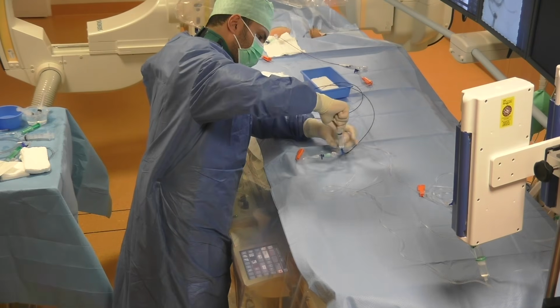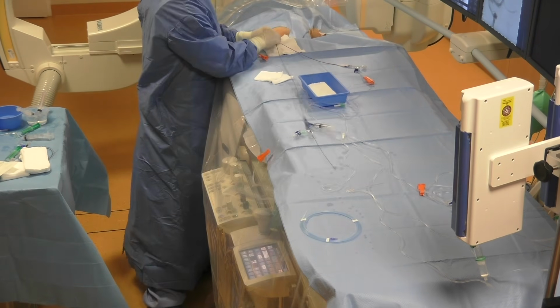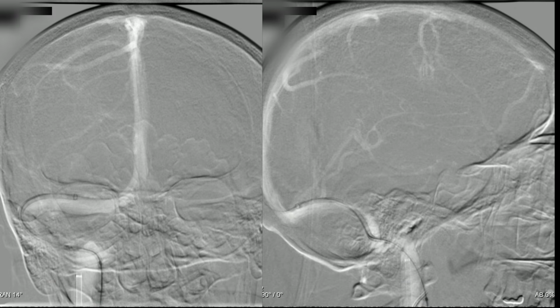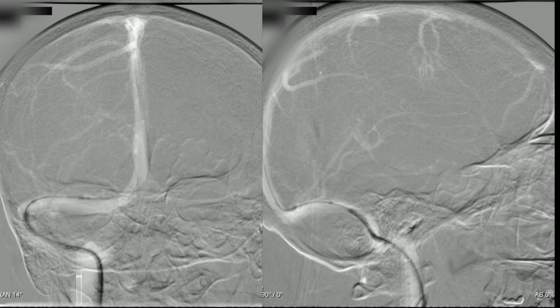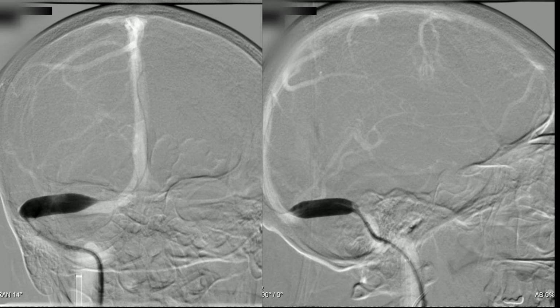It's a Mustang 10 by 30 millimeters, and here we need a 35 Terumo wire to bring it through the tortuous anatomy. After reaching the transverse sinus, we can pull back the Neuron MAX and start the PTA at the distal parts of the stenosis.